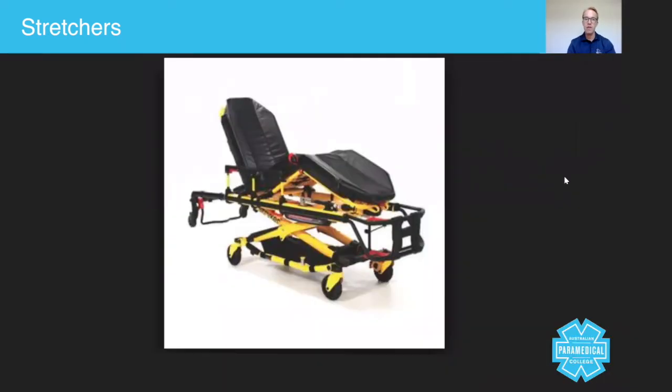We're not going to go through any particular design. The college does use a certain type of stretcher, but you'll be trained on that when you get to the workshops. Instead, let's just generically pick a random stretcher to look at, because most of the features are actually very similar throughout all the different brands. This is one of the electronic versions of the Stryker. Stryker stretchers are an American brand, and they're extremely popular amongst emergency medical service providers.